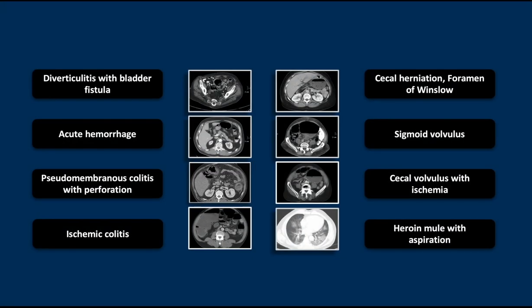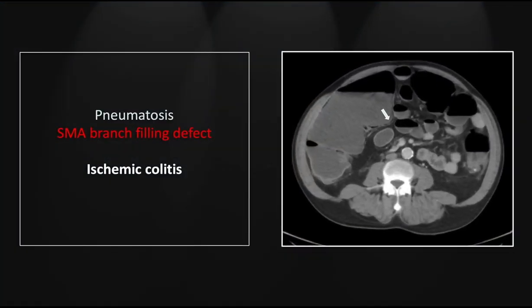Our next case is of ischemic colitis. This patient has pneumatosis on the posterior aspect of the cecum and ascending colon, obviously not obeying the laws of gravity and density. There is also a very small filling defect within one of the superior mesenteric vessels — wrapping around from the artery, lying immediately adjacent to the vein, which is patent and posterior.